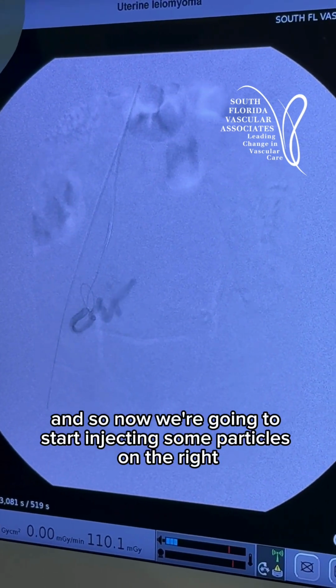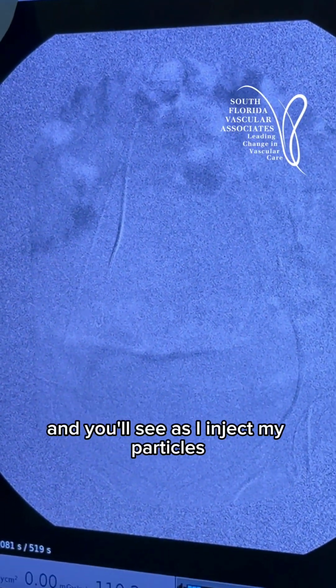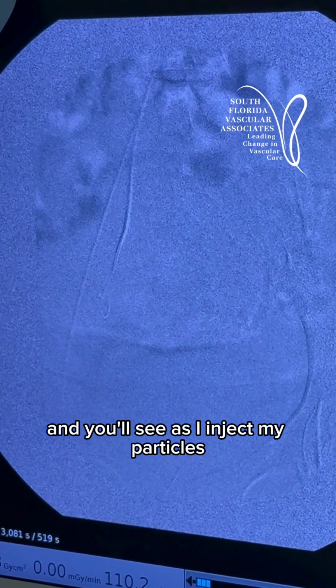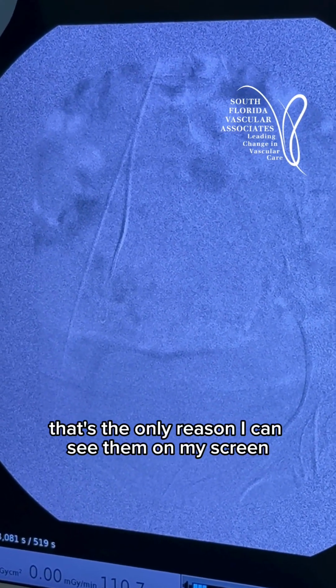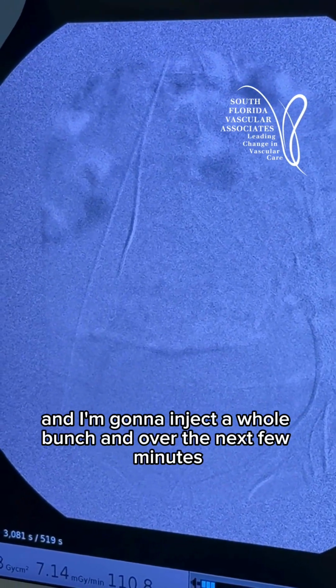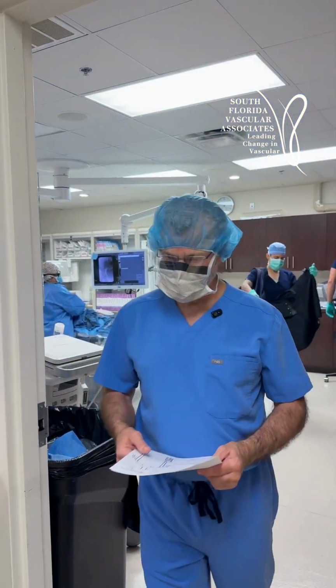And so now we're gonna start injecting some particles. On the right, we've already closed off the left. And you'll see as I inject my particles, they're mixed with X-ray dye. That's the only reason I can see them on my screen. And I'm gonna inject a whole bunch. And over the next few minutes, the blood flow will slow down a lot.